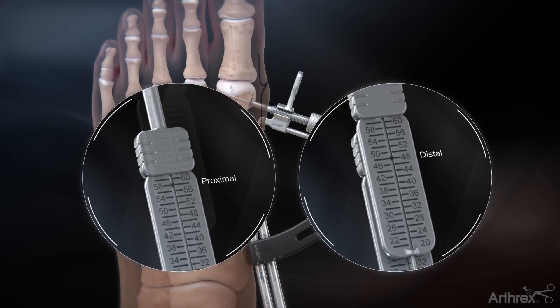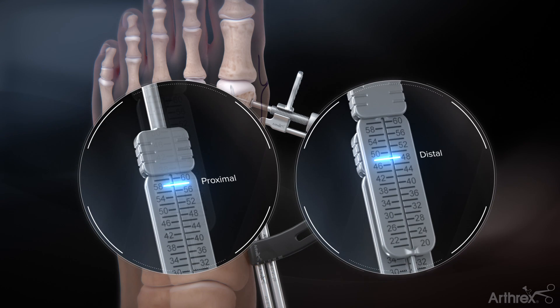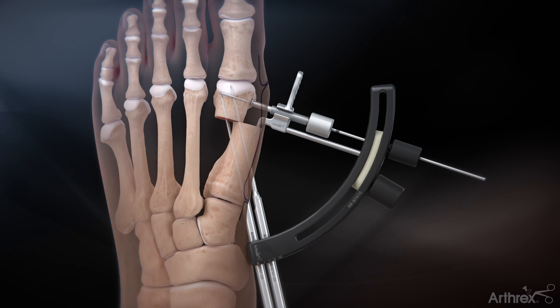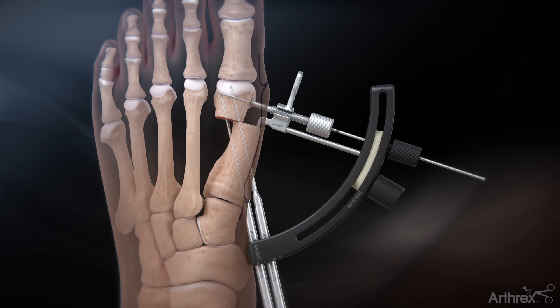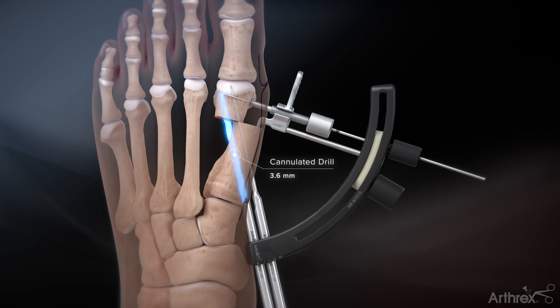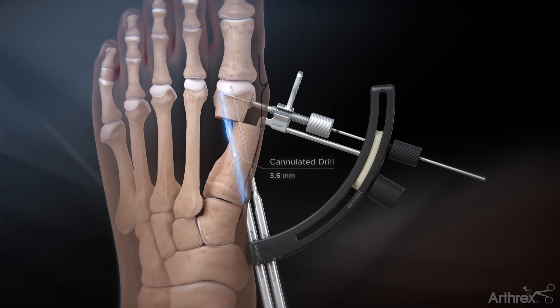Using the depth gauge, record the measured screw length from the laser marking on the guide wire. Remove the depth device, leaving the drill guide in place, and insert the cannulated drill over the proximal guide wire. Ensure that the drill is advanced over the complete length of the screw into the capital fragment.